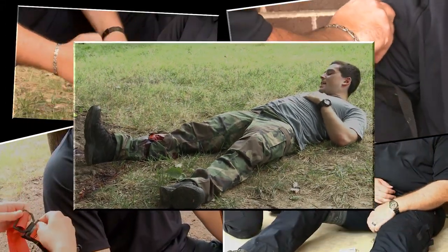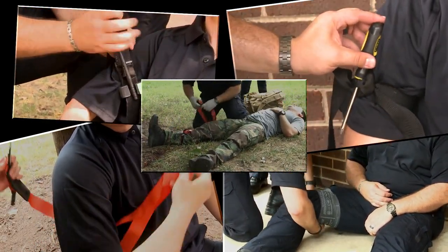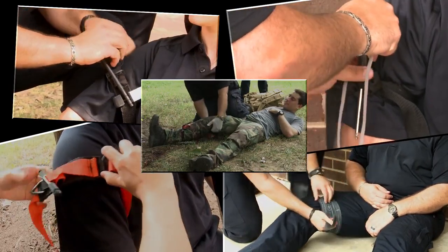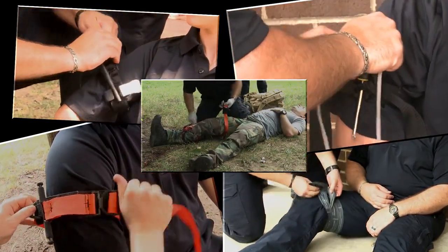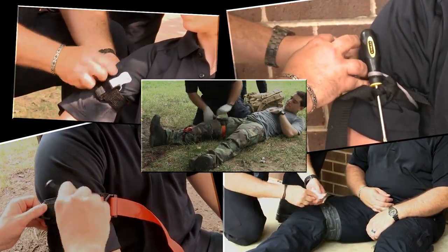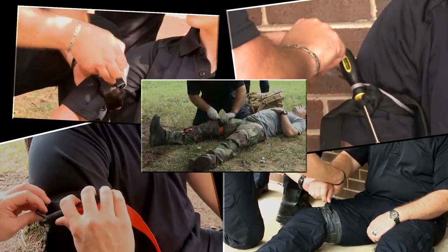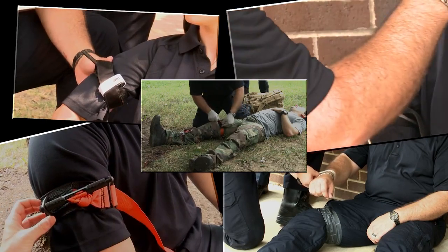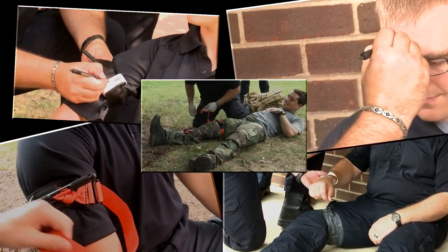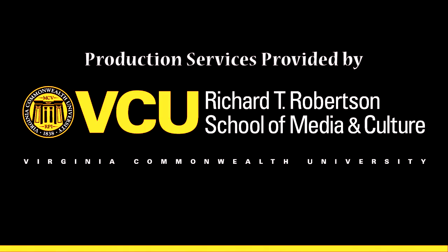Tourniquets are life-saving tools for serious hemorrhage. If you have any question of whether a wound is serious enough to require a tourniquet, it probably does. You will cause more harm by failing to apply a tourniquet to a life-threatening hemorrhage than by applying one when it is not indicated. The tourniquet should be tightened until bright red blood has stopped coming from the wound. It should only be removed to be relocated higher on the arm or leg. The time the tourniquet was applied should always be recorded.